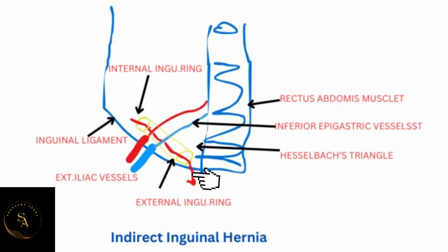Now, when these visceral organs enter the inguinal canal, it can either stop inside the inguinal canal or move directly into the scrotum.